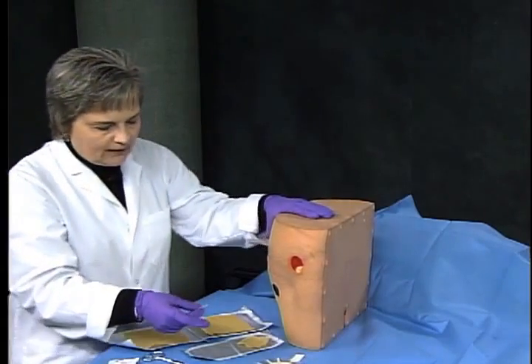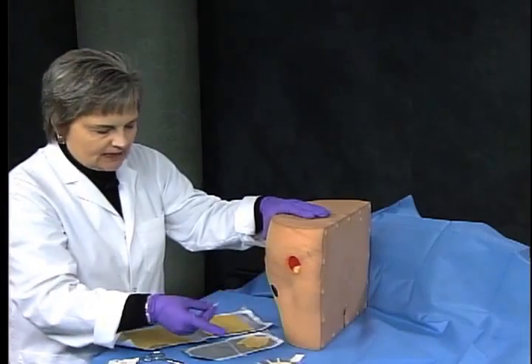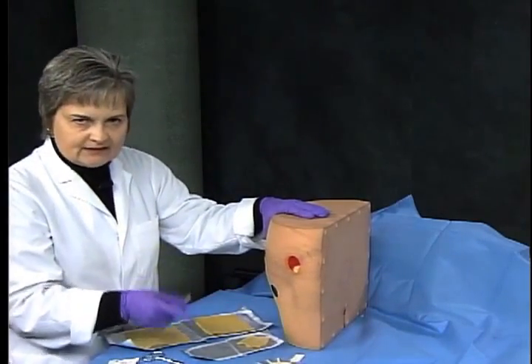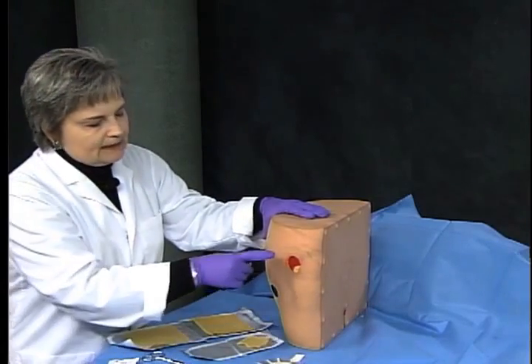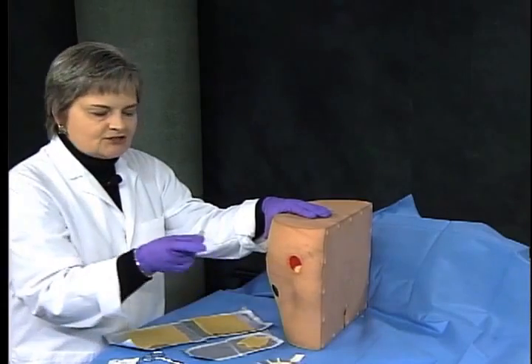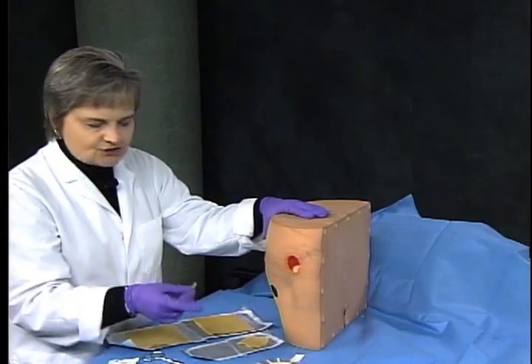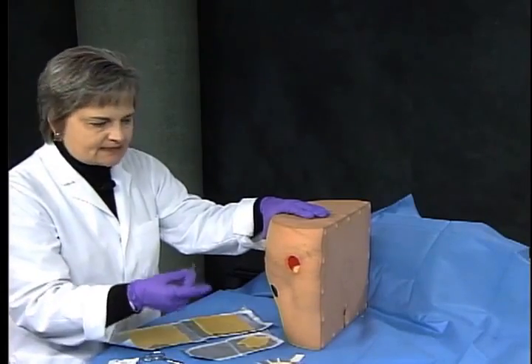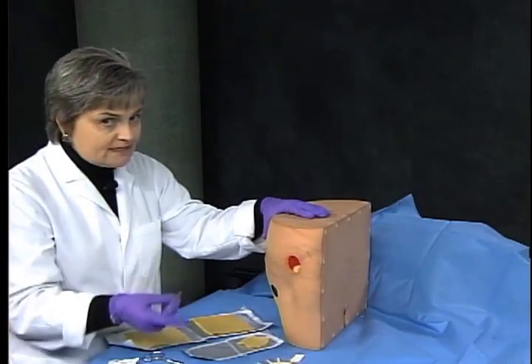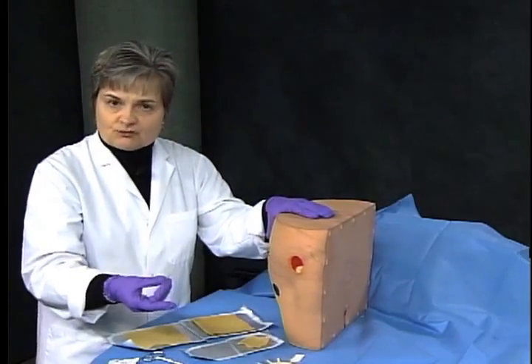And so what I would do is I would first measure the wound, and then I would cut the dressing, and now I need to make a judgment as to whether or not I need to moisten this dressing. Now, if this wound has sufficient drainage that it's going to moisten the dressing, then I don't need to add additional moisture. I can just put the dressing into the wound dry. But if there's any doubt, I'm going to moisten the dressing.